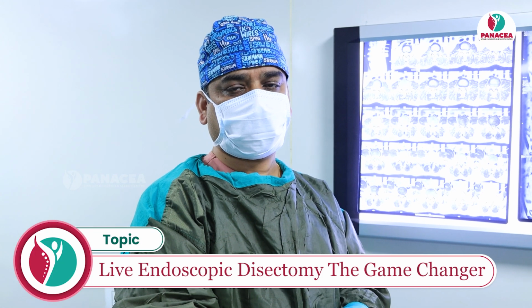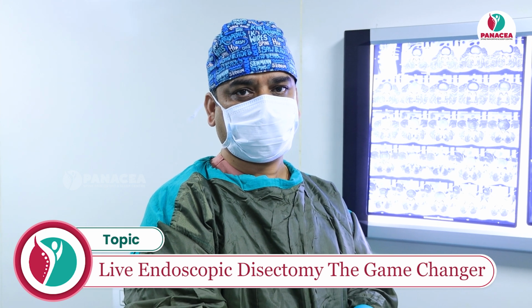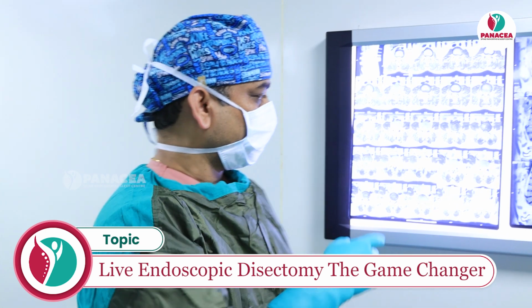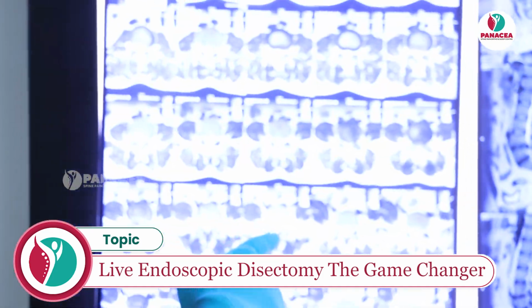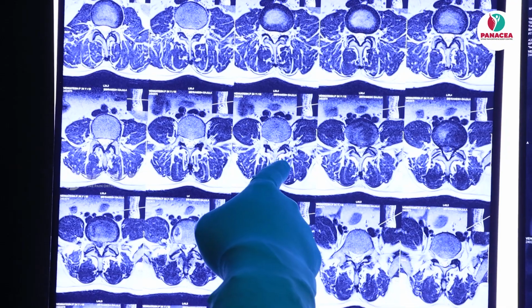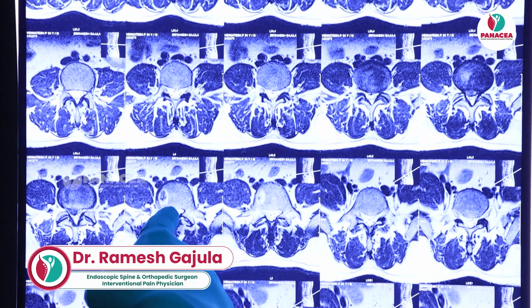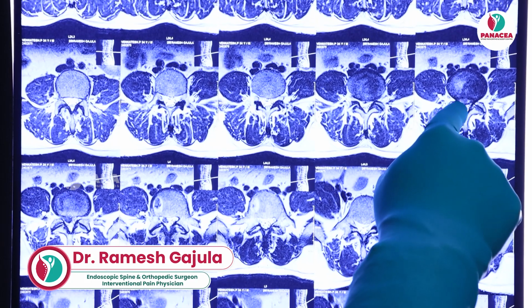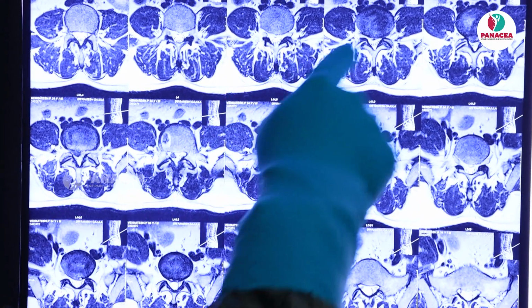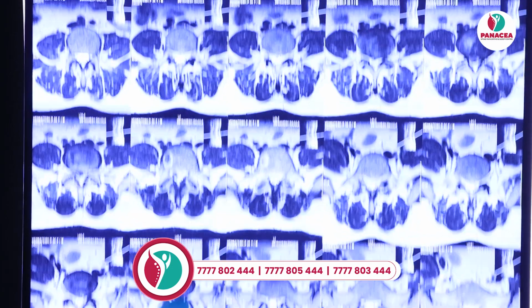We are going to operate on a middle-aged male patient with lumbar disc herniation at L4-L5 radiating to the right lower limb. You can see, zoom here, this is the MRI of the patient. This is the L4-5 upper end plate cut, and these are disc cuts, and this is the lower end plate cut. If you see here, there is a disc herniation here, on the right side, and it is down migrating. These are axial cuts, and at L5-S1 there is also an annular tear.